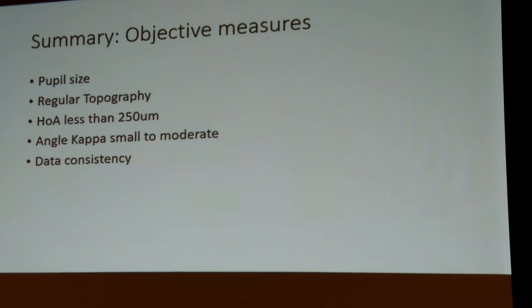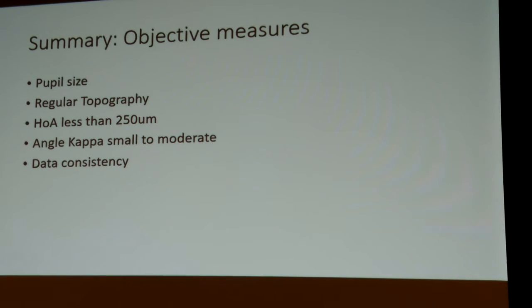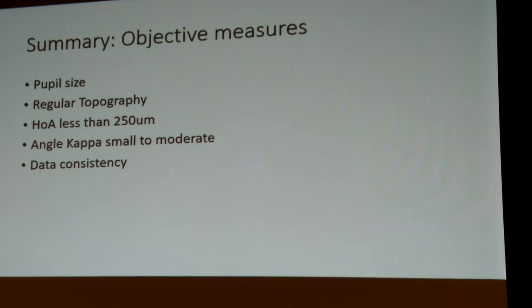It needs a bit more time to think about it beforehand, but for the surgeon I'm working with, they tell me if I put the lens in nasal, the near segment nasally or inferior, doesn't matter. I just put it in.